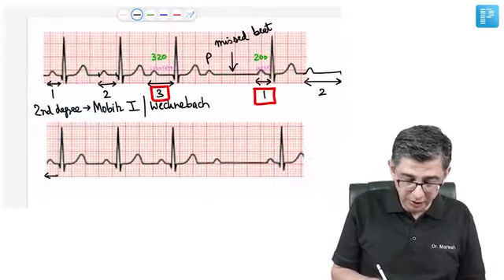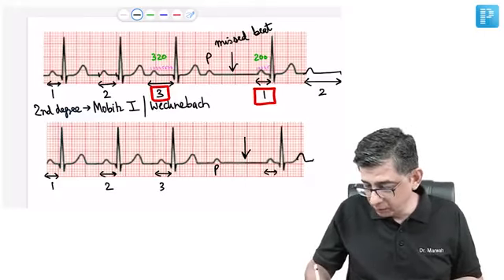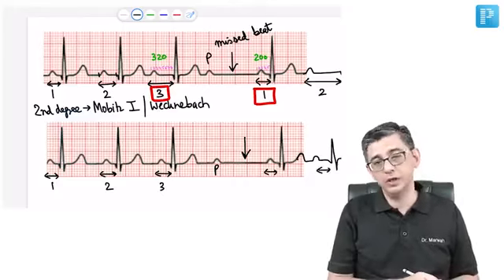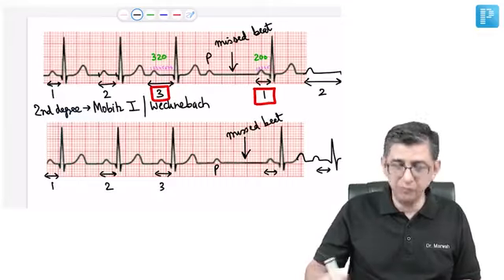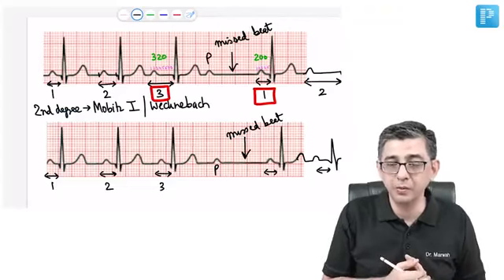Then there is a P wave, followed by waiting, a missed beat again present, a vertical arrow will be present, and then again the rhythm is reset and you would be getting a PR interval, and then subsequently you would again be getting a PR interval. But the message is that the PR interval that comes subsequently will be almost of the same size. What you need to do is, once again, identify the missed beat. The person might again say, sir, suddenly I feel as if my heart is sinking, and I put my hand on my pulse and the pulse is disappearing.